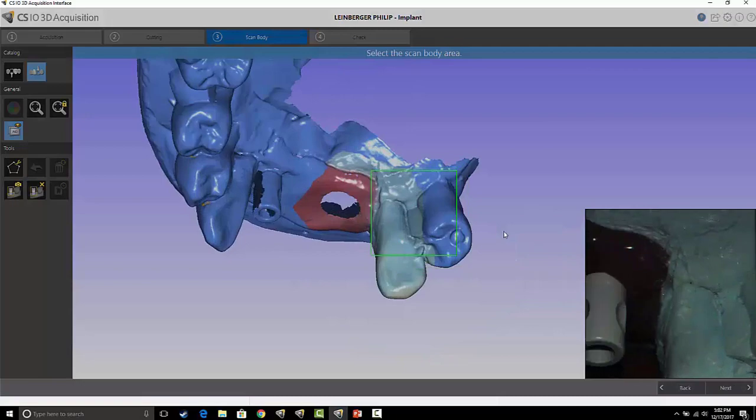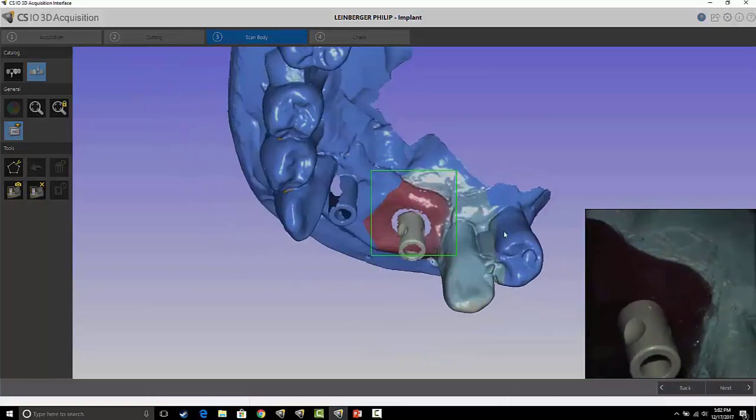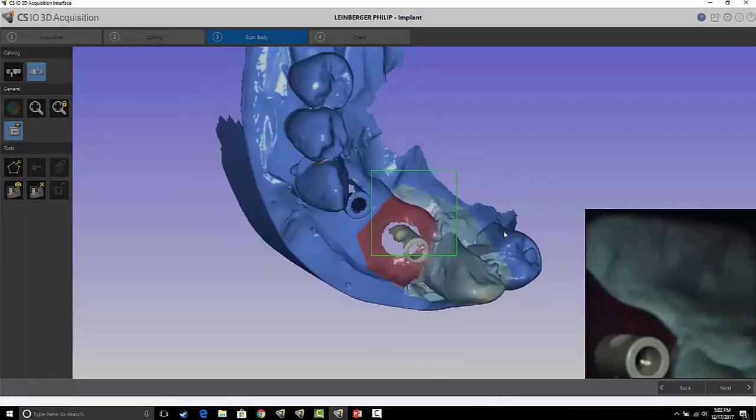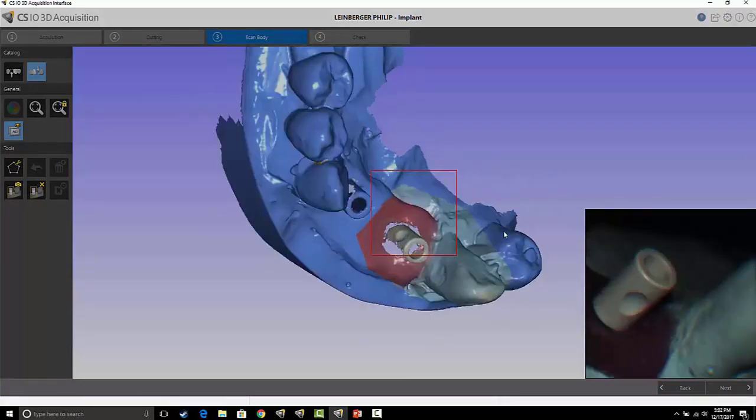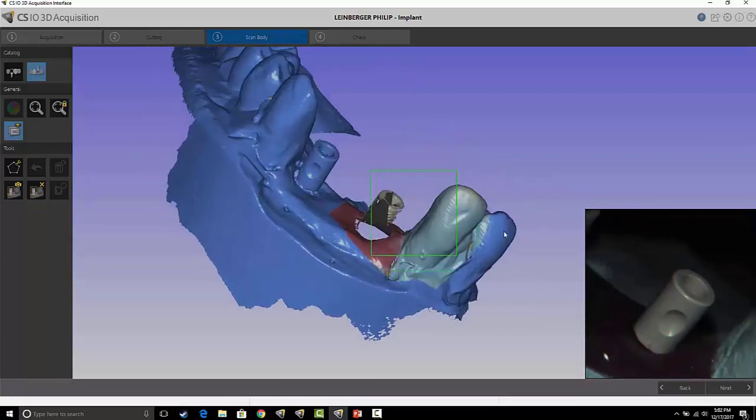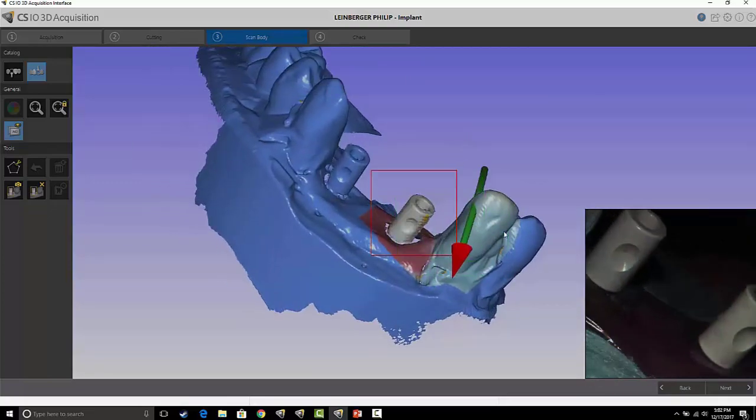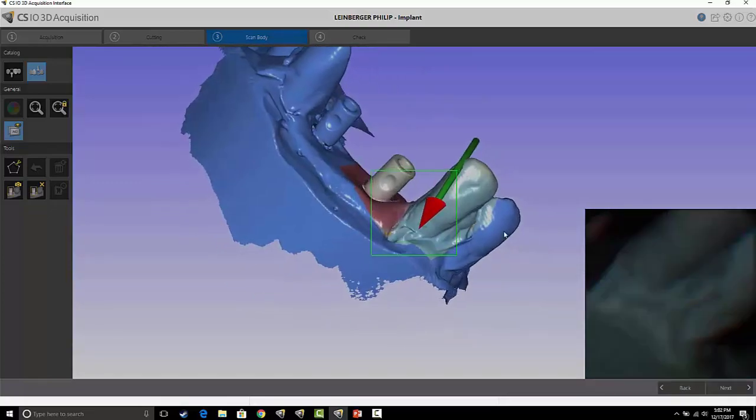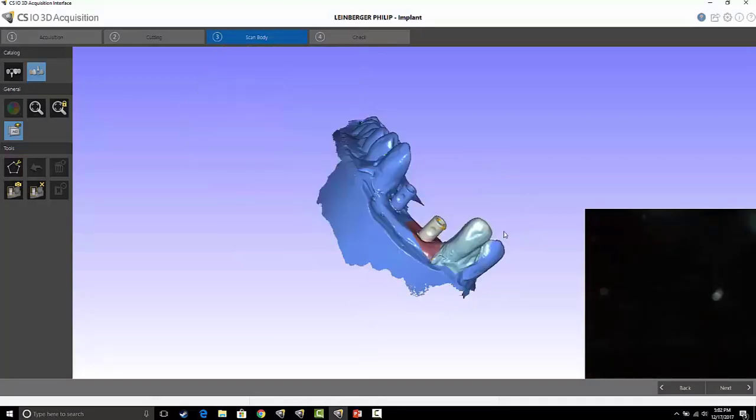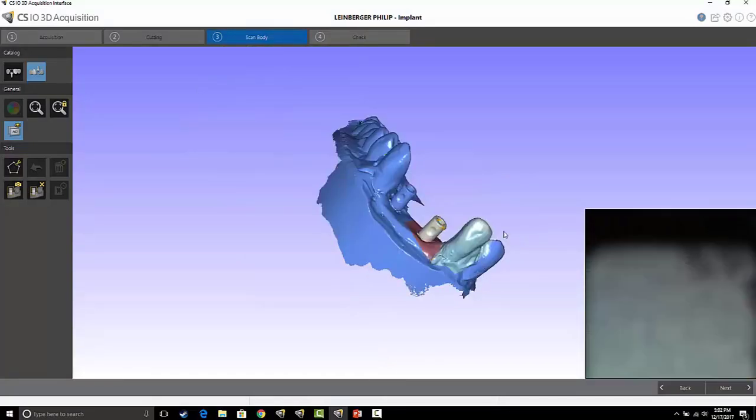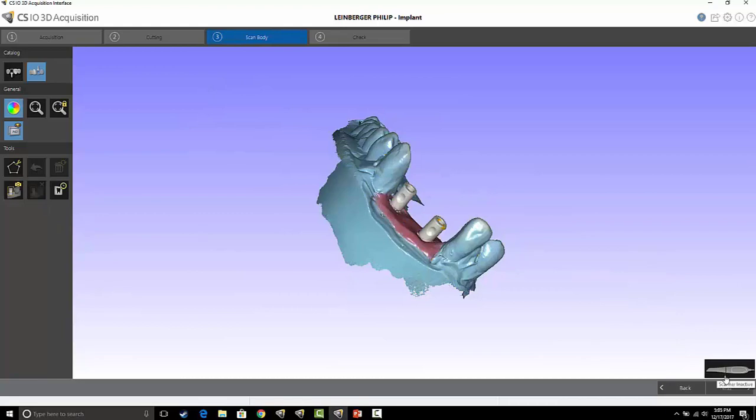If your last scan body is all the way on the posterior where there's no tooth posterior to that last scan body, you can always use additional tissue to the distal or to the buccal and lingual for that little reference spot to re-register the scanner. Then you're done.